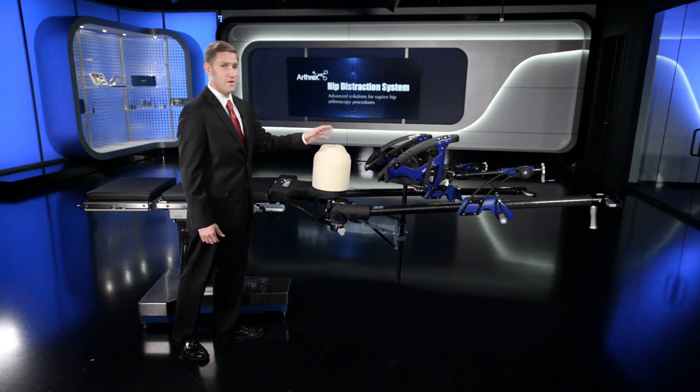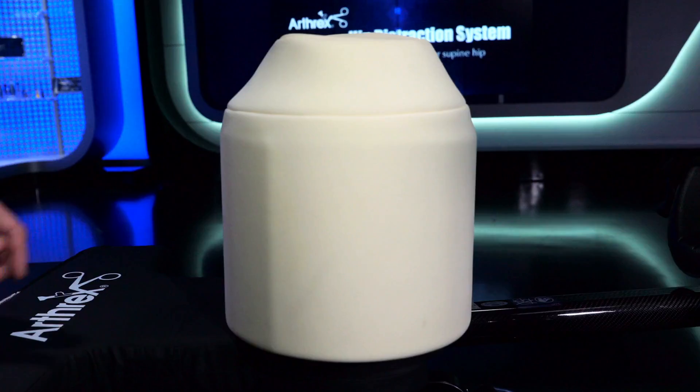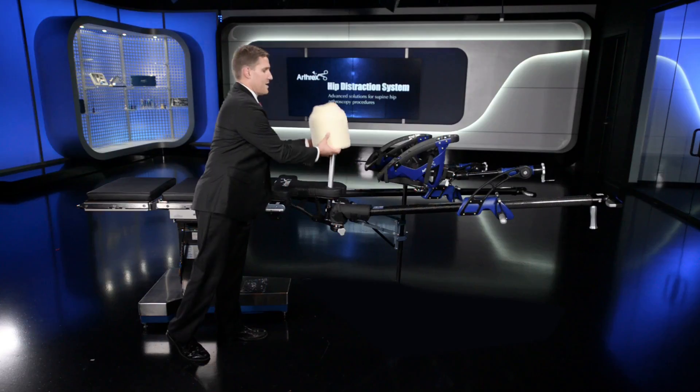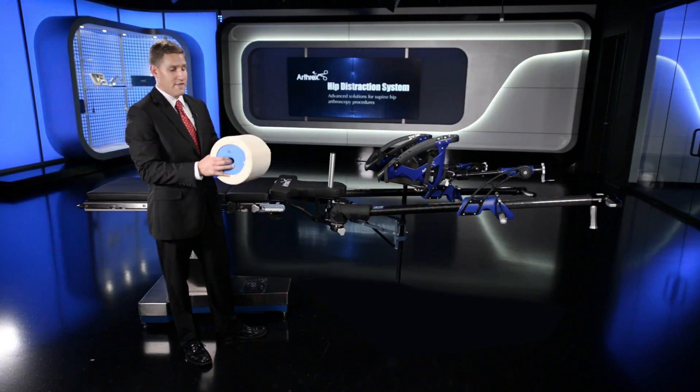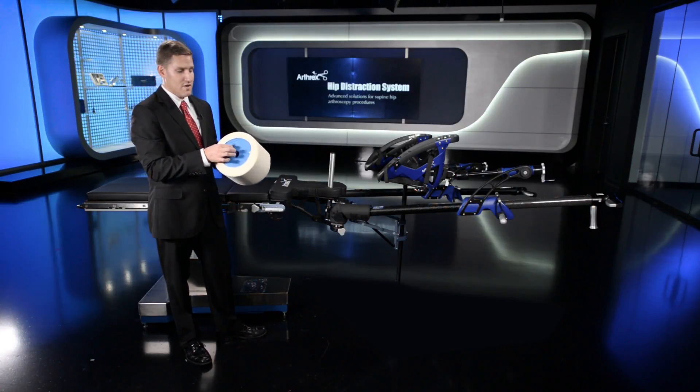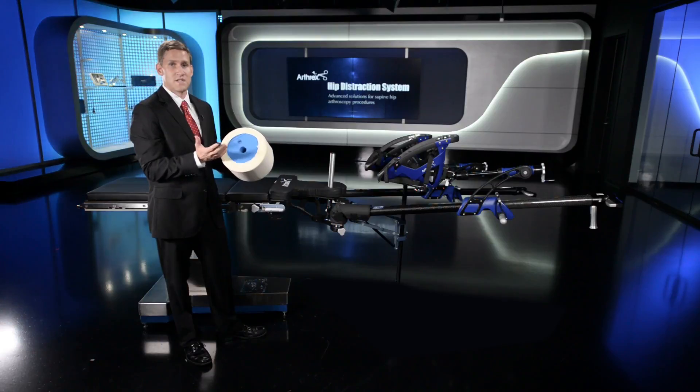The C-arm can be brought through the leg spars or on the non-operative side of the patient. Additionally, the perineal pad is a reusable memory foam chamfered cut style oversized pad that comes in two different densities. There's also a disposable cover that comes just for hygiene purposes.